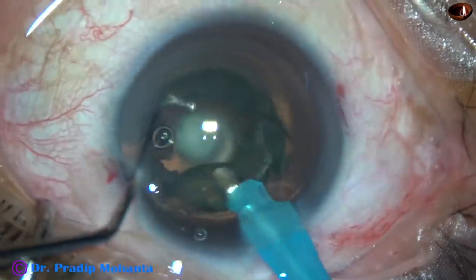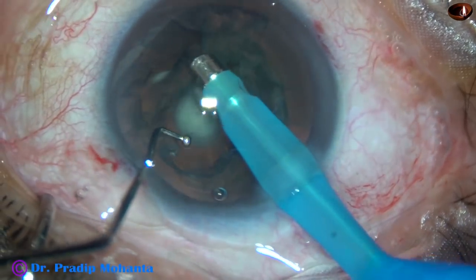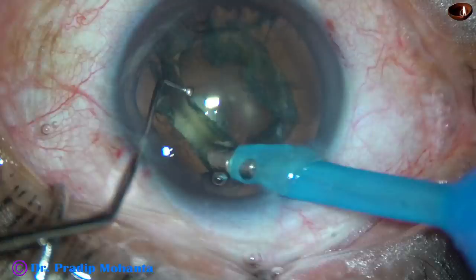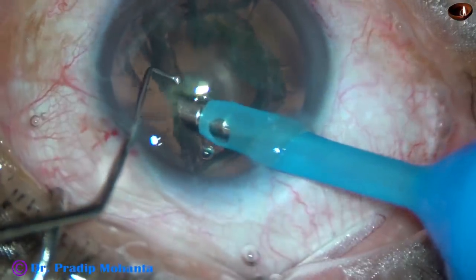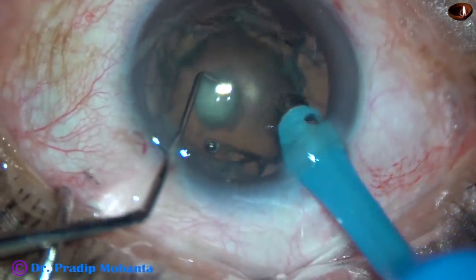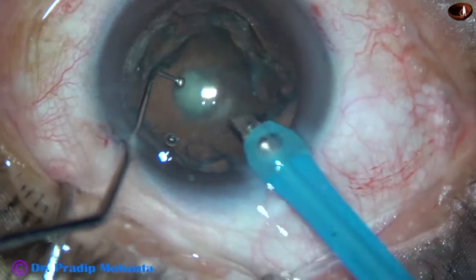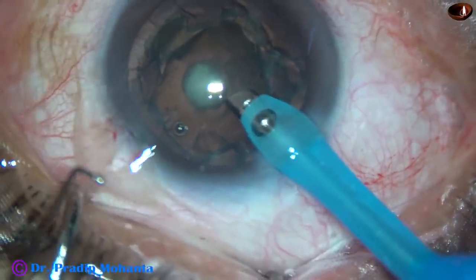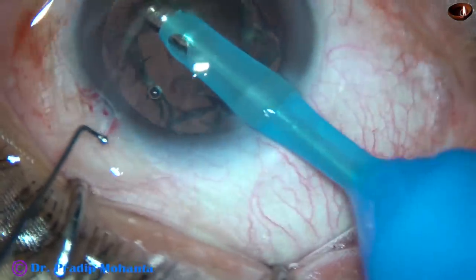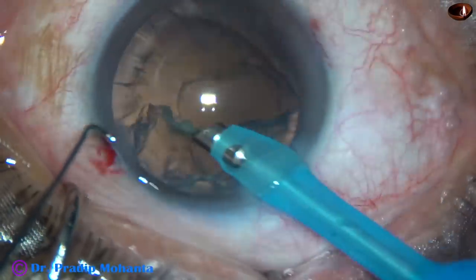This is a very soft cataract so it came out easily. And now this mistake starts. I am trying to aspirate this without hydro-dissection. And here I go to so much periphery. This is blunder number one. And here I probably touched the posterior capsule. And here I have made a tear already. This is blunder number two. So without hydro-dissection I tried to lift off the epinuclear sheet from the posterior capsule with high vacuum. This is not a mistake — this is a blunder, and I must not repeat this in my surgical career.